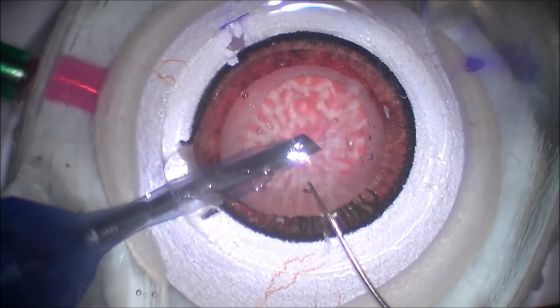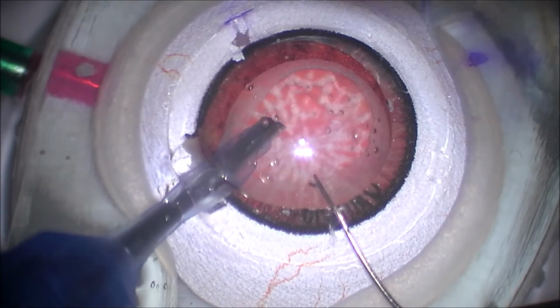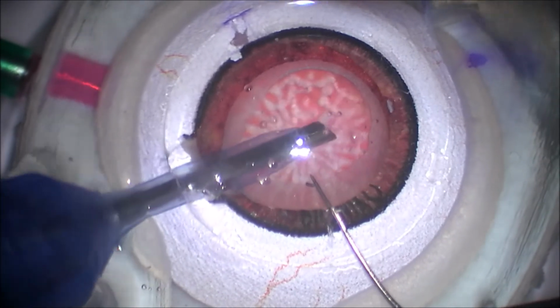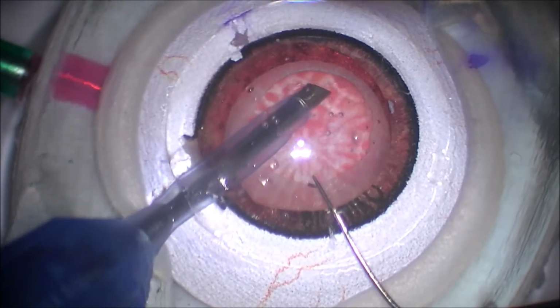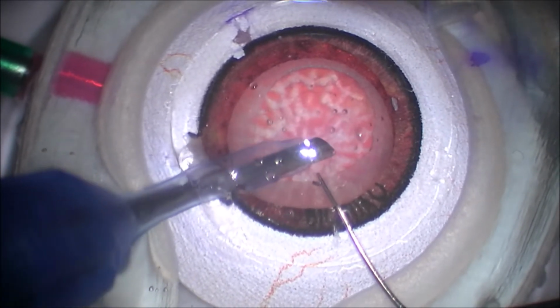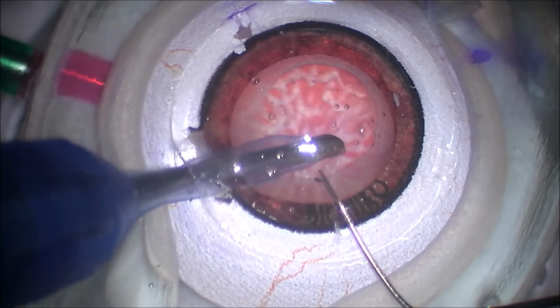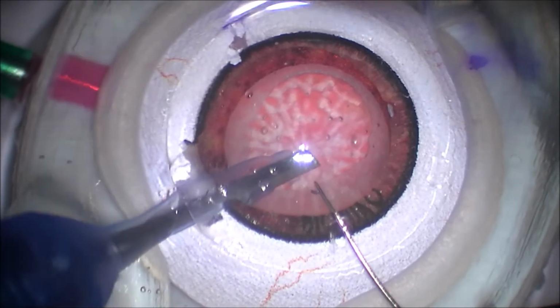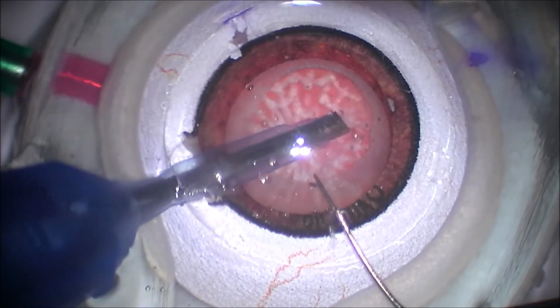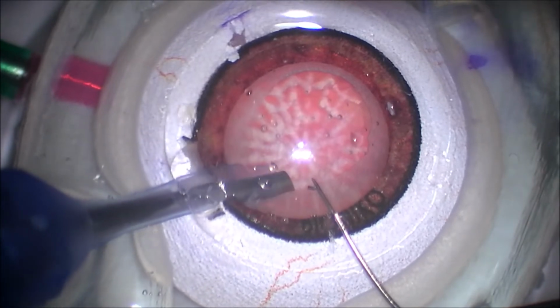So again, you can see she's primarily using aspiration and vacuum to grab those pieces out of the bag. It's essentially just locked into place. But again, very, very carefully, she's trying to grab those pieces little by little. Again, it's hard to simulate sculpting with this case, and difficult to allow the lens to spin freely within the bag. That would certainly be more of a tissue simulation. This is really more of a maneuver simulation, learning how to manipulate your instruments within the incision.